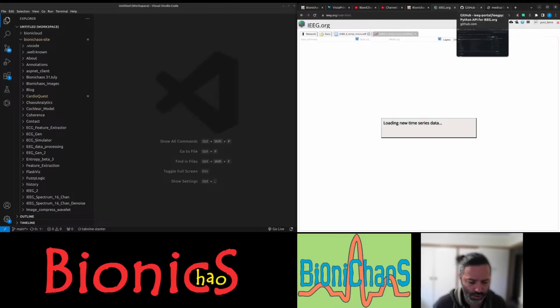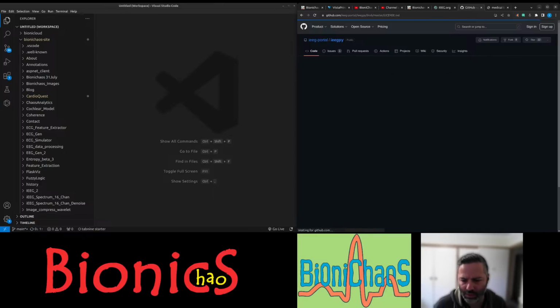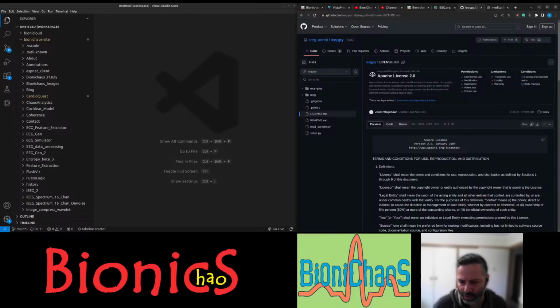While it's loading, let's check the GitHub page. So at the University of Pennsylvania, looks impressive. I don't know anything about it, that's why it looks impressive. Seemed to be updated 4 years ago, 8 years ago. License, I don't know what the license is. You can check it later. I assume it's an Apache license, which is great. Permissions: private use, any commercial use, yes. So very permissive license. We'll need to place a notice, so essentially keep the same license in our project, which we can definitely do, especially if we just fork it. There are already 8 forks.